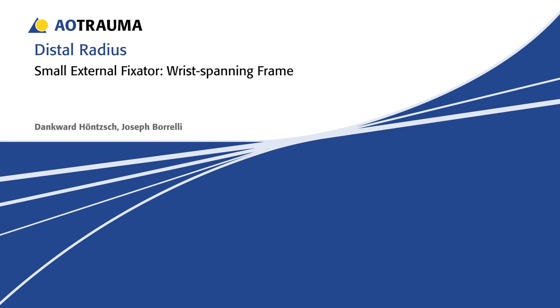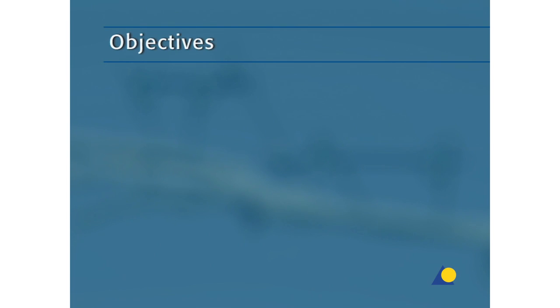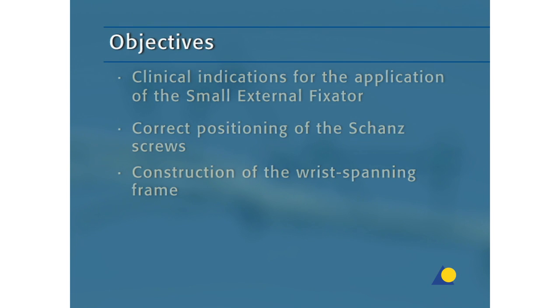In this presentation, the construction of a wrist-spanning frame with the small external fixator will be demonstrated. The objectives of the exercise are to understand the clinical indications for the application of the small external fixator, the correct positioning of the Schanz screws, and the construction of the wrist-spanning frame.